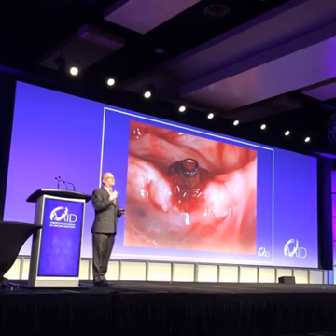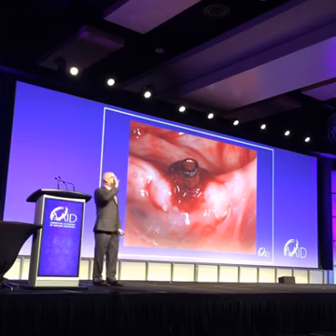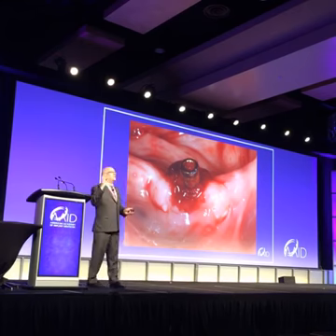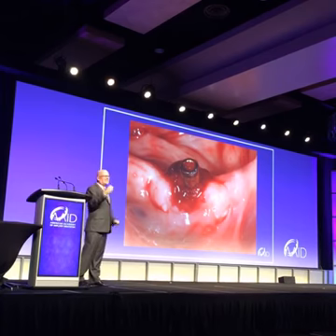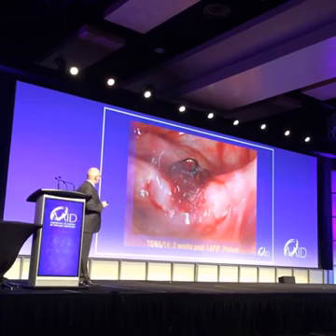Who cares? I just went to a lecture where the guy says take a diamond burr and shave off all the threads. And we're worried about, oh my God, the laser touched the implant. Oh, my head's going to explode. That implant surface is already gone. It's already been contaminated. All I can do is make it healthier. So there you go. That's what it looked like.